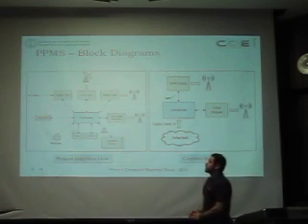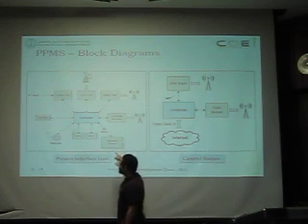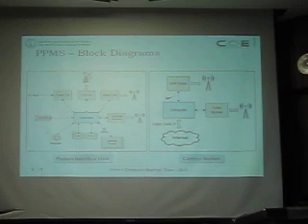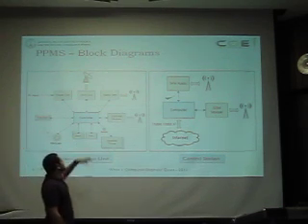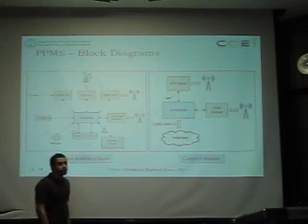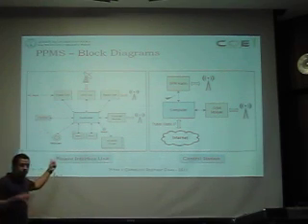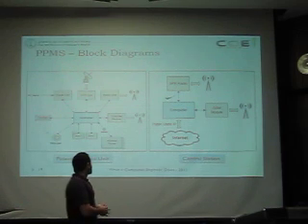These are the block diagrams of the patient interface unit and the central station. These are the different components of the patient interface unit. We have, as we said, 4 communication standards: the radio through the radio unit, 3G and GPRS and SMS through the 3G and GSM module. And we have also a webcam to start the webcam stream over the patient.